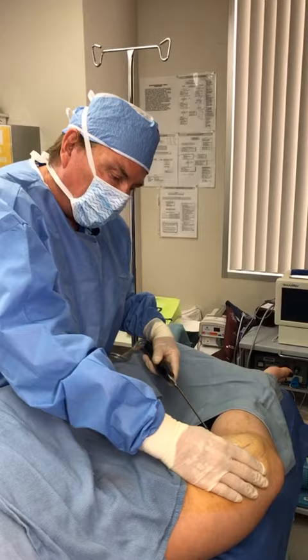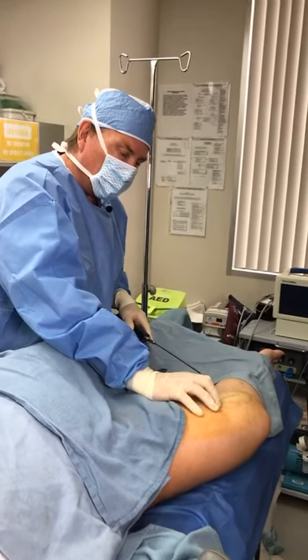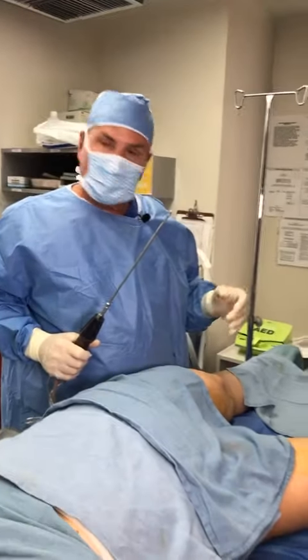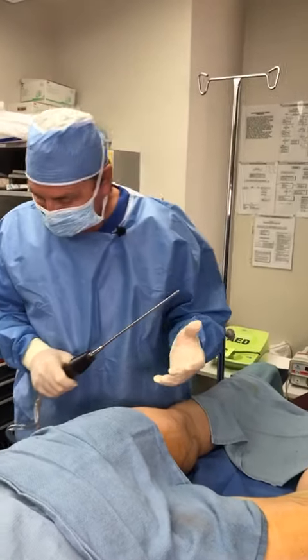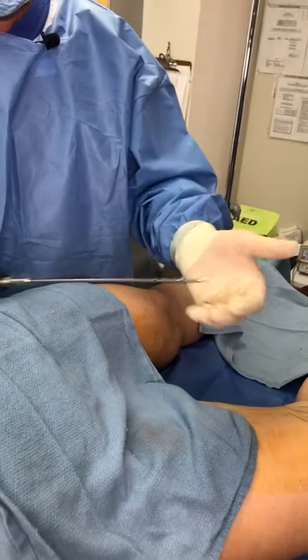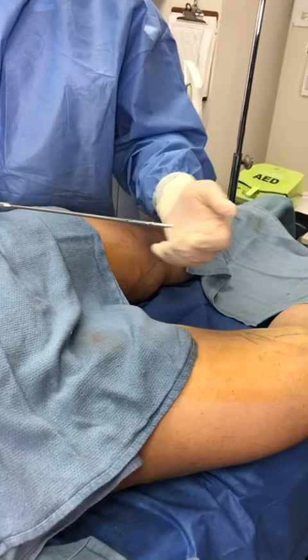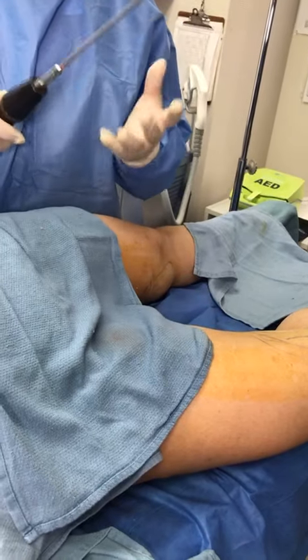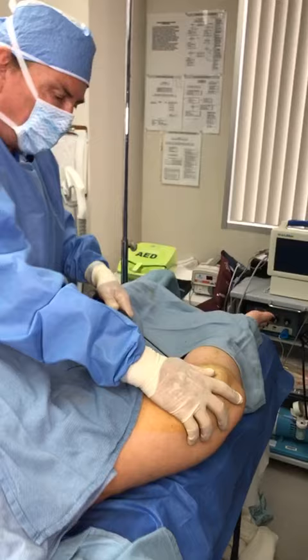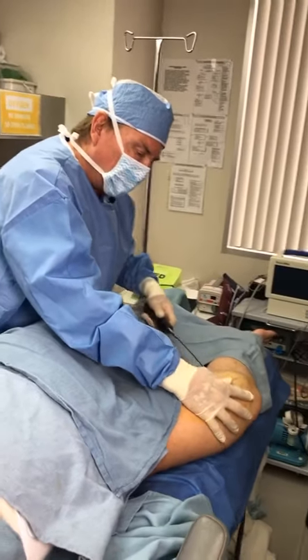That includes whether it's your inner thighs, outer thighs, tummy, love handles, bra line fat, or armpit fat — we can get to all of those areas. The nitrogen gas allows the cannula to slap against the fat, and there are no sharp edges like regular cannulas, which are cutting and tearing. This does not. It thins out the fat and then lightly suctions it, so we have a lot less trauma with tickle lipo. I love it.